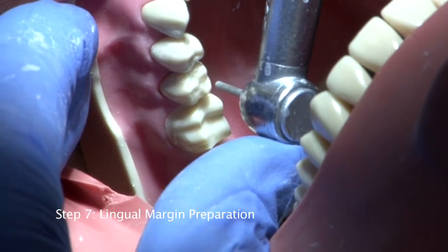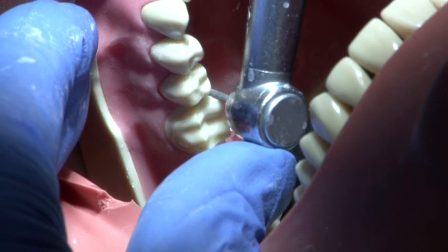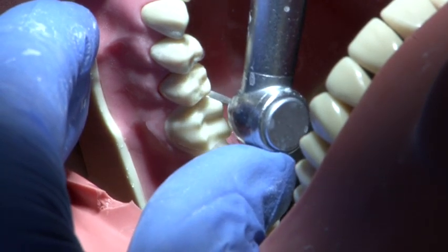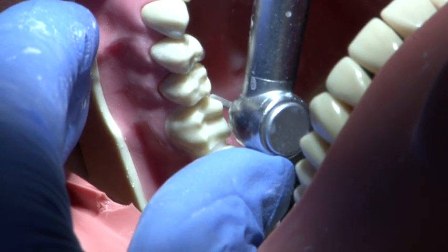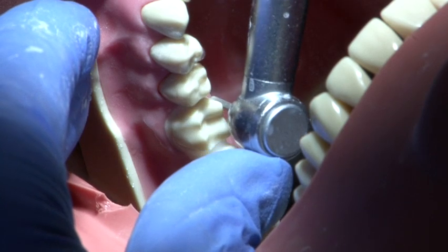The lingual surface is prepared to a depth of 0.5 to 1 millimetres and a chamfer margin employed using the parallel sided medium grit round end burr. Again a smooth action is used and the handpiece is supported at all times.